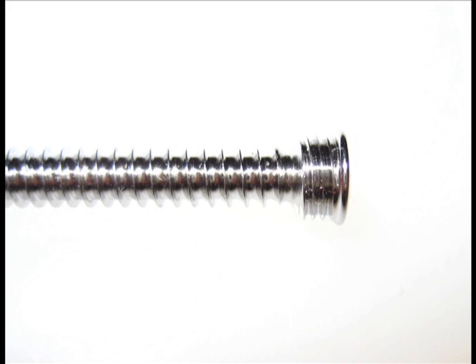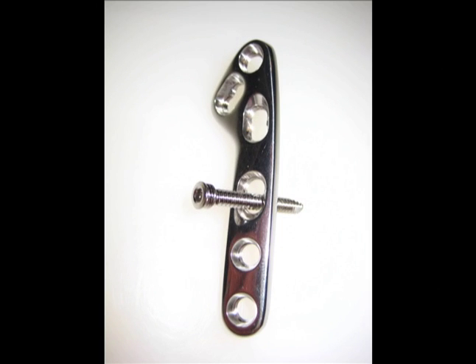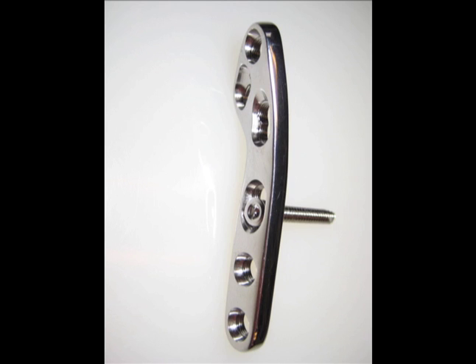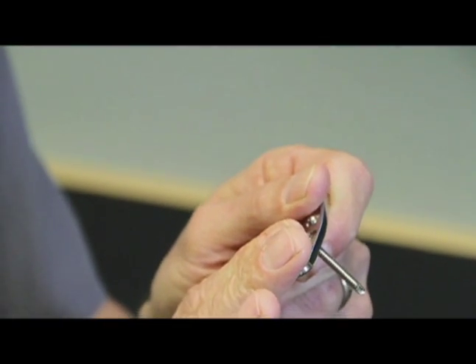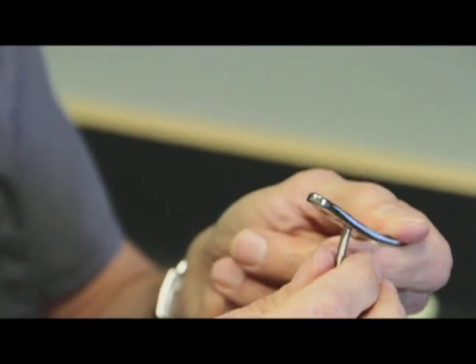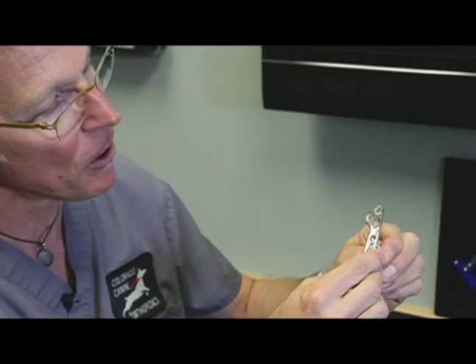The way this screw works is it has threads on its head, and then of course it has threads that engage the bone. So as we put the screw in and tighten it, it will go into the bone, but then it also tightens into the plate, and it secures into the plate. So it's very rigid. It's called locking plate technology, and it improves immediate postoperative comfort. It improves the time to healing, and it's been a great innovation. So that's the plate that we put on.